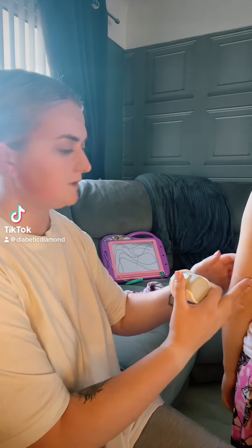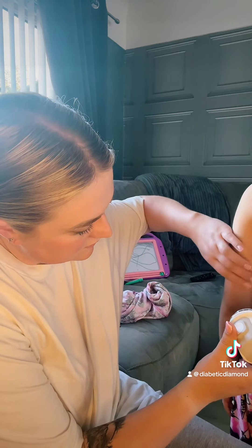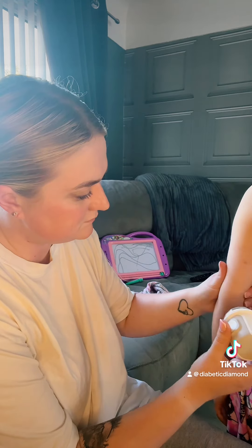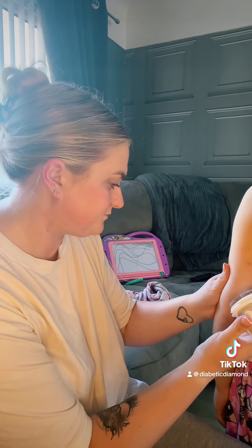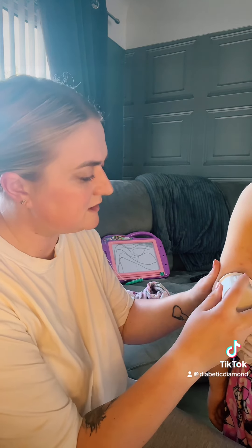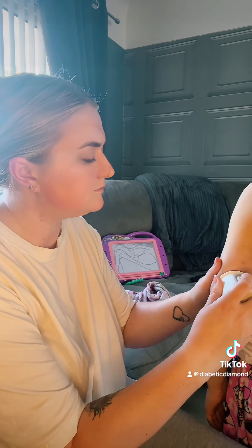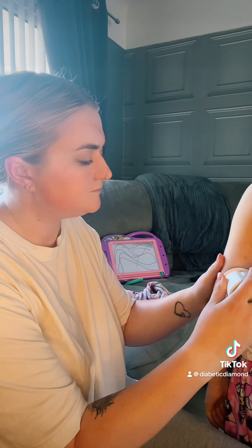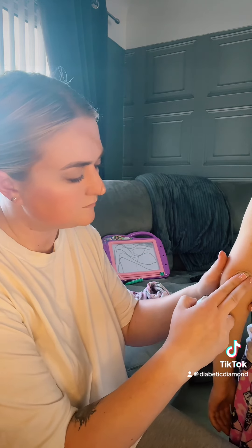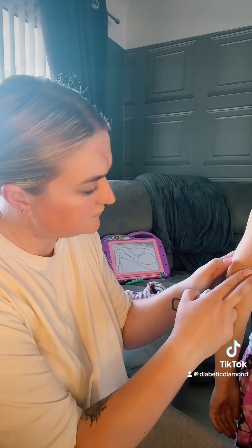Right, you've just faced that way. Relax your arm down so I can get her in the right place. Ready? One, two, three. You okay? Is it bleeding? No.